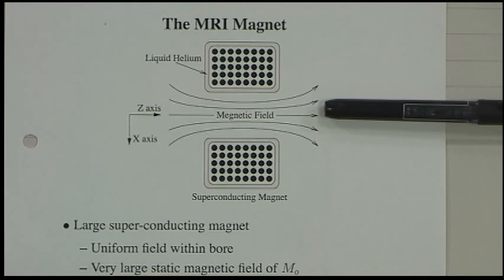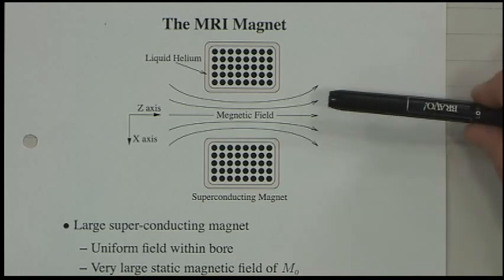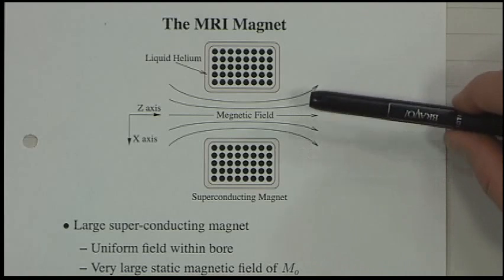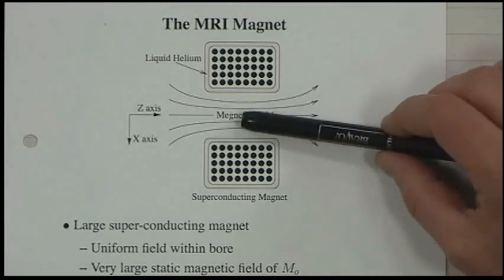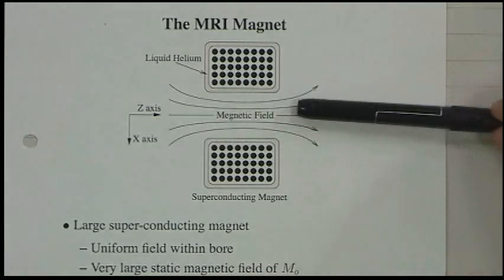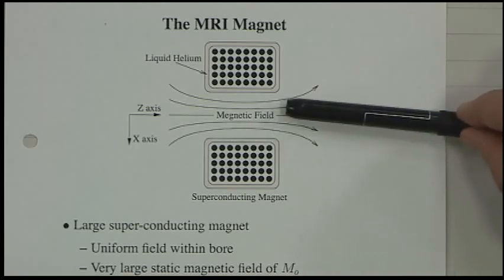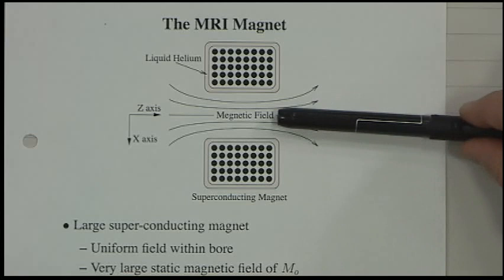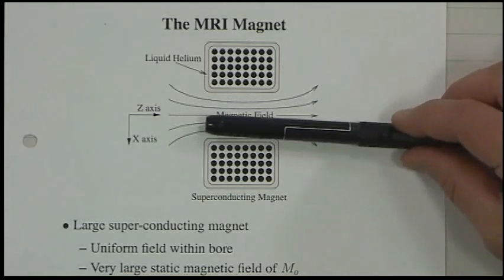So that's a very high field strength, 3 Tesla or 1.5 Tesla. To achieve that kind of field strength in any practical sense, you also want a relatively large bore so that you can get people in here, and actually people seem to be getting larger with time. So getting a large enough bore is a significant issue.